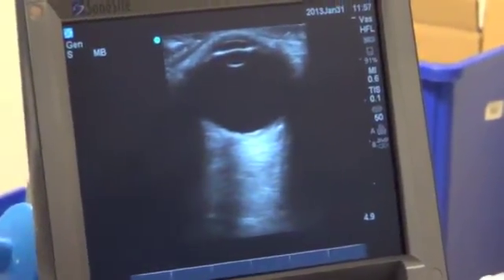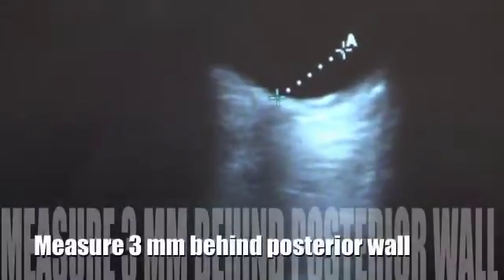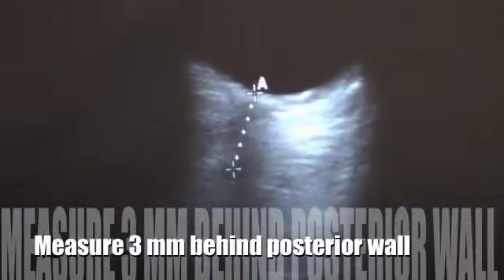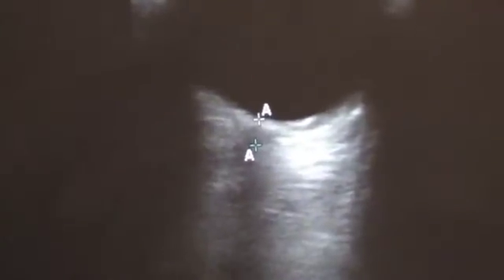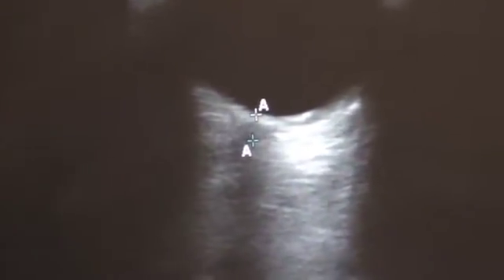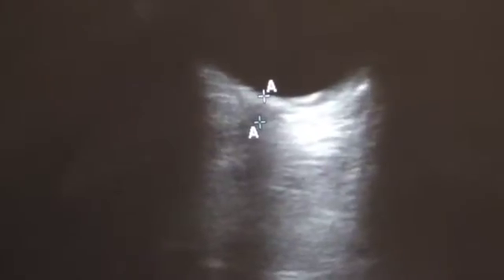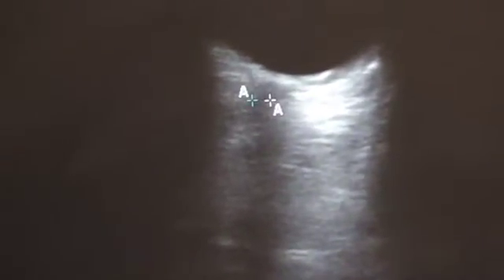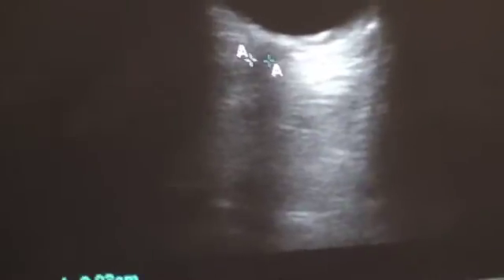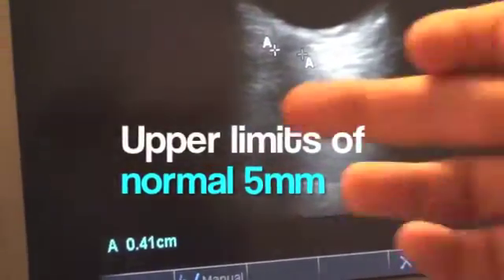Freezing the image will allow you to take measurements. Go ahead and bring up your calipers. You'll want to measure down three millimeters, because that's going to be the area where you want to measure the width of the optic nerve sheath. So you'll see 0.3 centimeters. You'll want to set that, and then measure from the inside to the inside of the structure — from where you start to see it become hypoechoic all the way across. As you see here, it's 0.4.